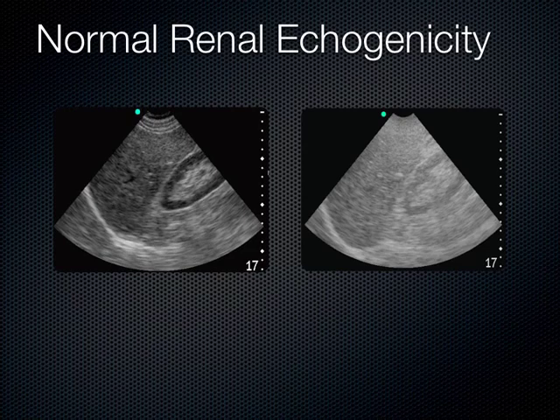Normally, the cortex of the kidney is less echogenic than the next-door neighbor — the liver on the right, or the spleen on the left. If you can make out that the renal cortex is slightly less echogenic than the adjacent organ, then you can appreciate the subtleties of gain.